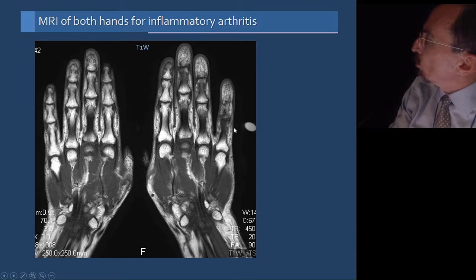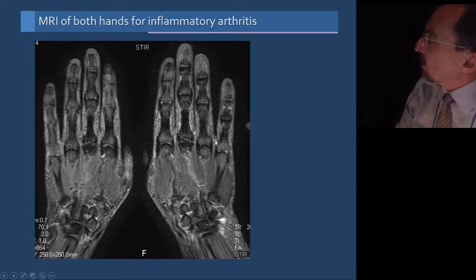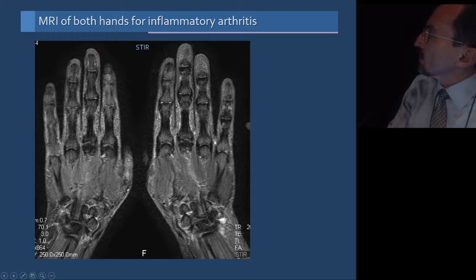But it is important to put a marker there because of the changes of the orientation in the images. We advise our technicians to put some marker to show us the right side. So we are in agreement with them that the MR imaging marker would show the right side. So this is how it can also be obtained with both hands side by side.